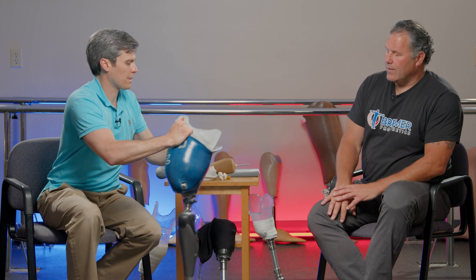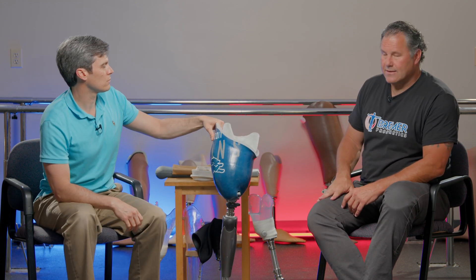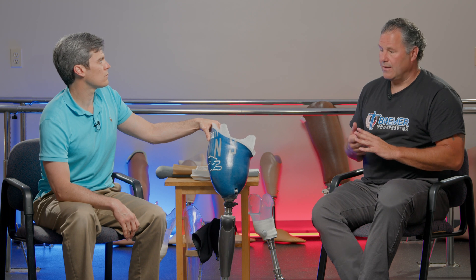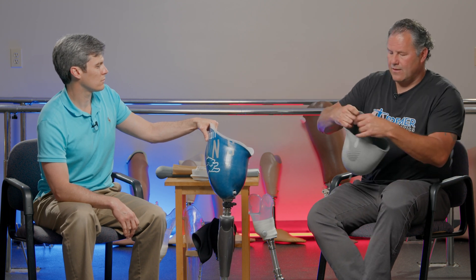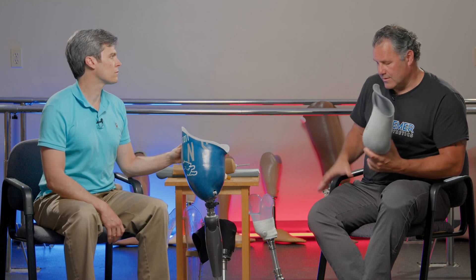Gel liners have really changed things as far as aiding in suspension. Two things are going to cause skin breakdown inside of the prosthetic socket: pressure or friction. With the gel liner on the bone, and it's different than with the transtibial because with the transfemoral we have a lot of soft tissue on the thigh, but there can be some prominent bony areas — everybody's limb is different, bone spurs. So it does add a layer of protection, which can be significant for some individuals.